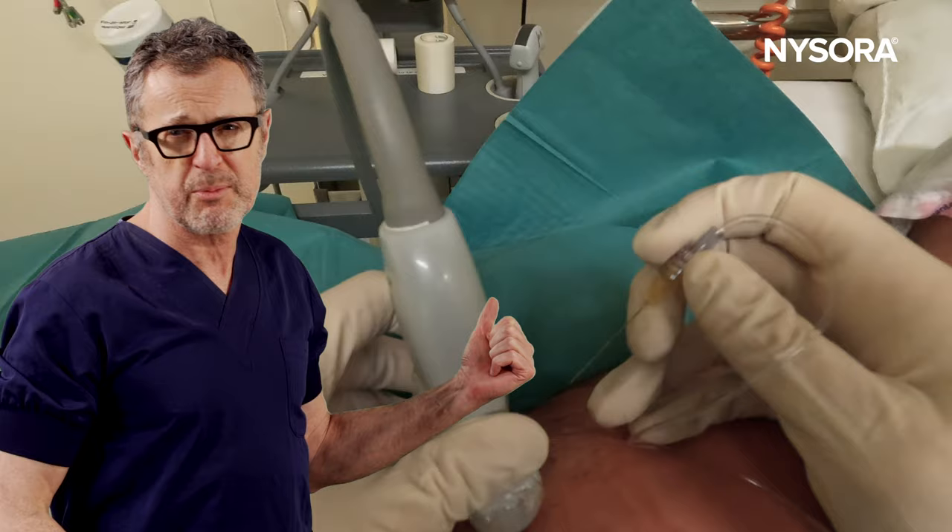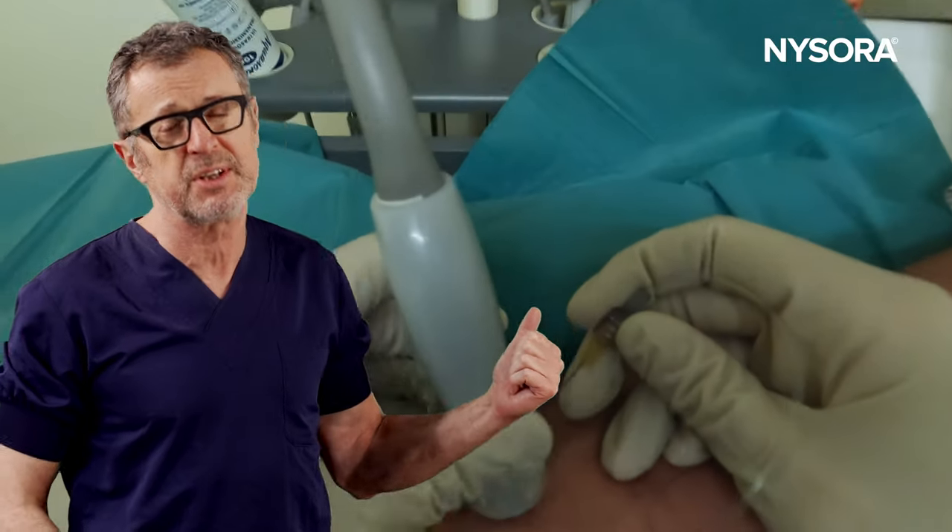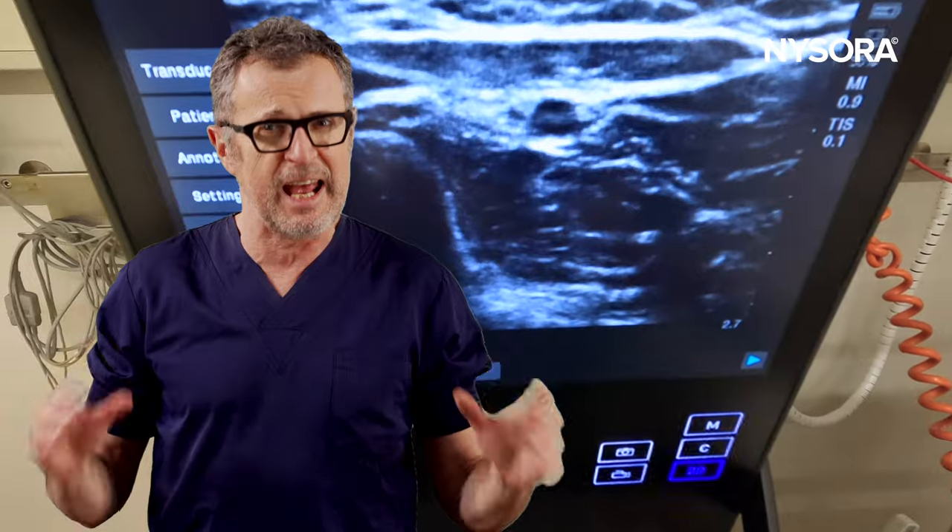In this video, we're going to demonstrate how to do a selective distal branch of the radial nerve block using the in-plane approach.